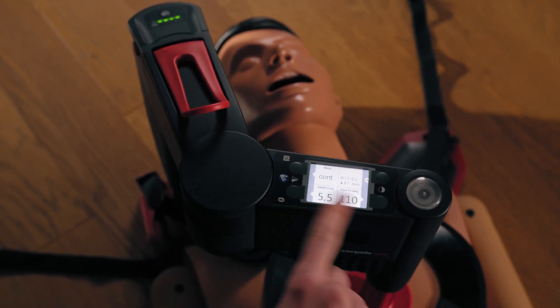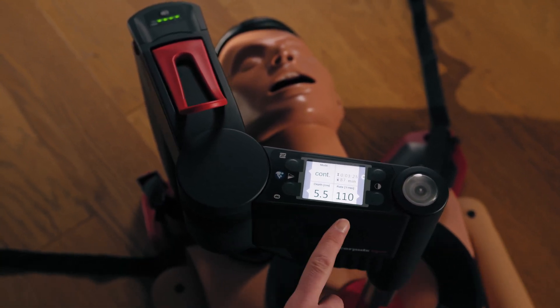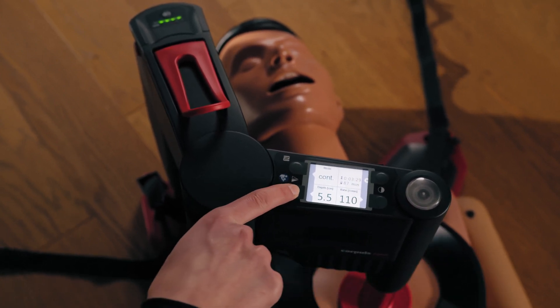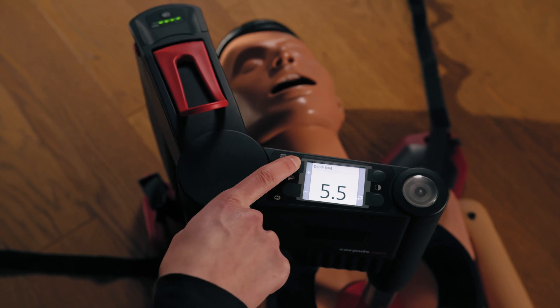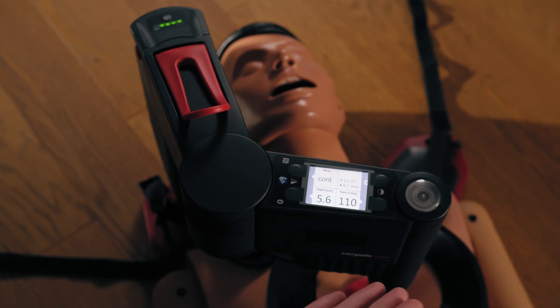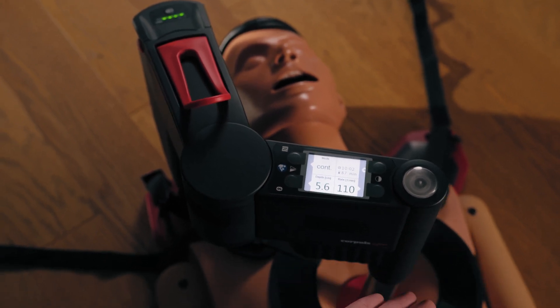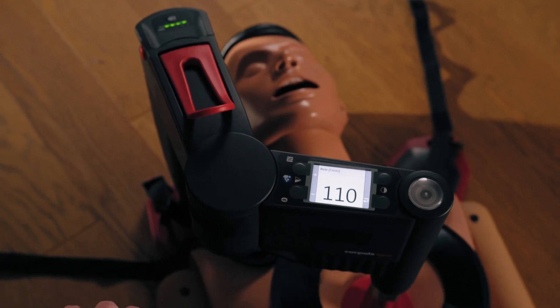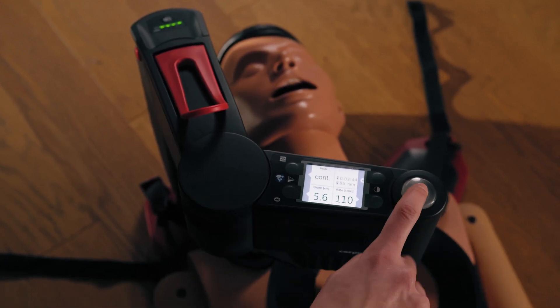You can also change the clinical parameters — depth or rate — should the need arise. To do this, click the soft key next to the corresponding value and use the plus and minus to go up or down. You don't have to click back, and the device adopts the setting automatically without you having to confirm it. The same also applies for the rate.